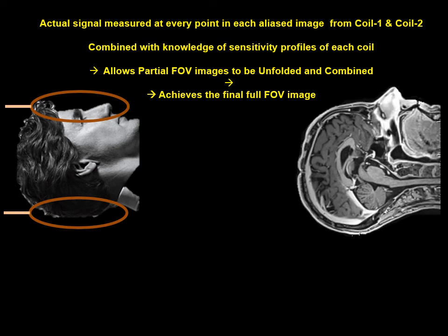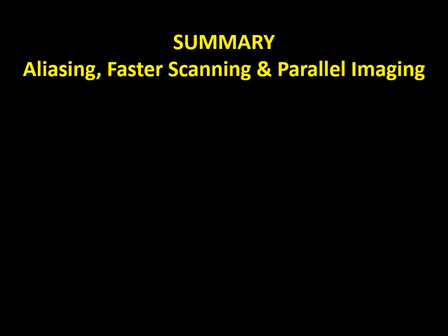And that's the final image, unfolded and unaliased, achieved at half the time, but at a 40% reduction in signal to noise. This brings us to the conclusion of this lecture.